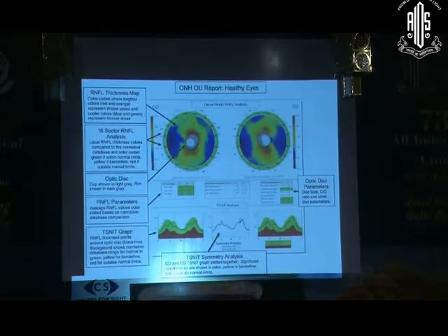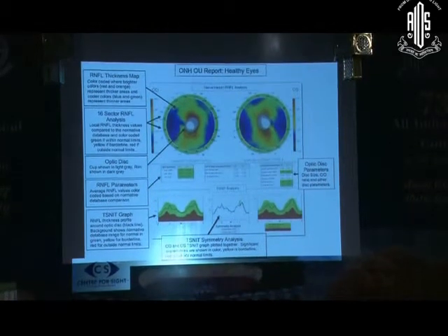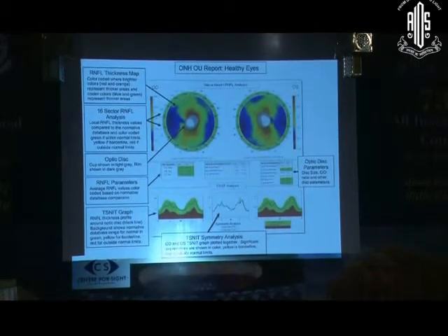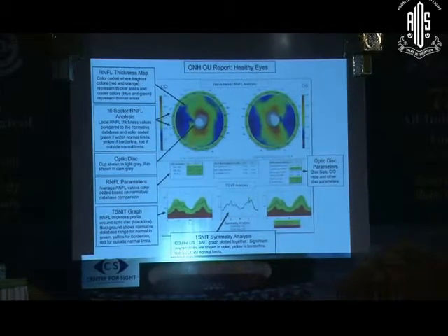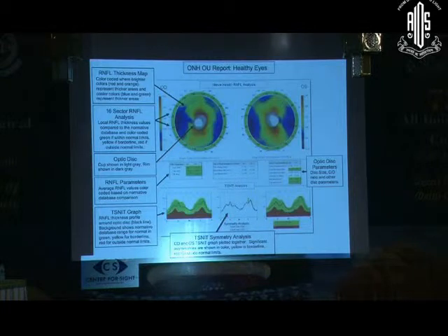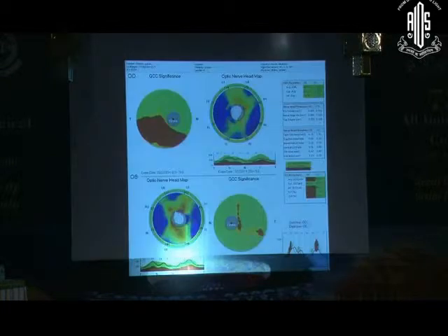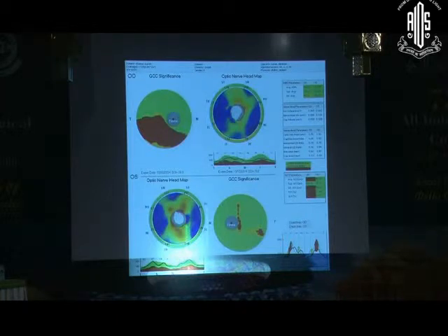This is a normal ONH report showing optic disc parameters. For RNFL parameters, always look at the symmetry analysis — usually an inter-eye symmetry difference is less than 12 microns. This comprehensive map shows the ONH as well as the GCC and the parameters on the right-hand side.